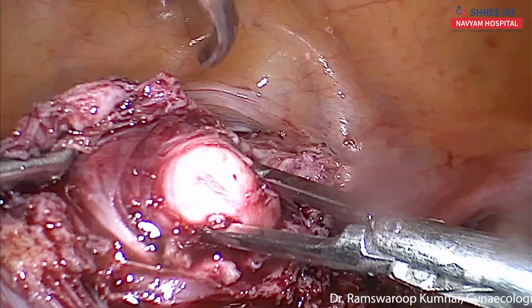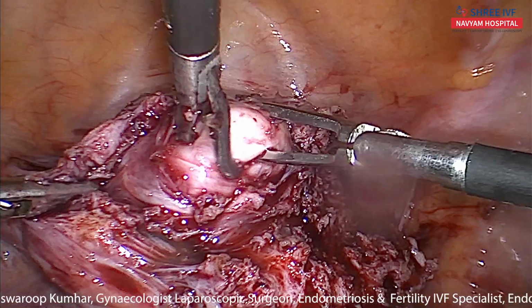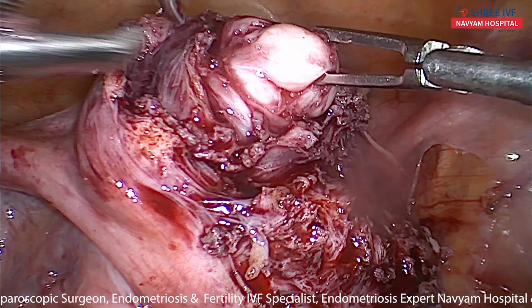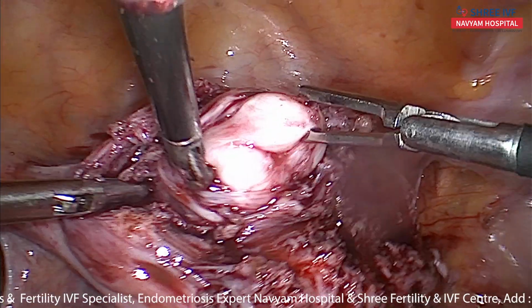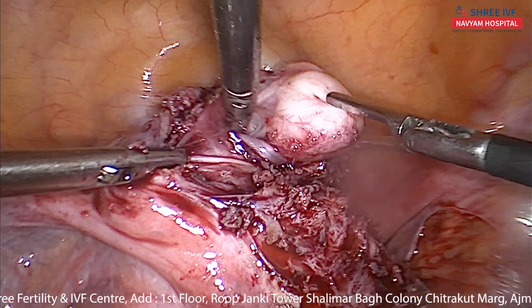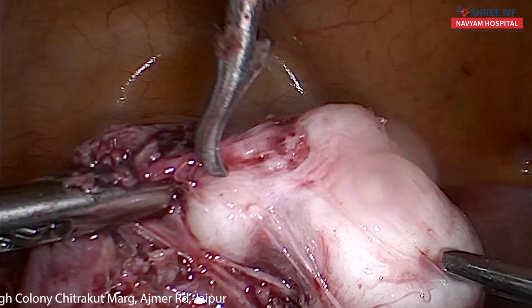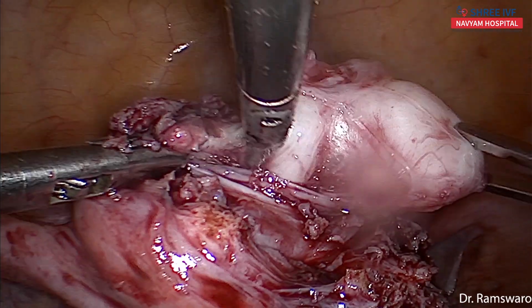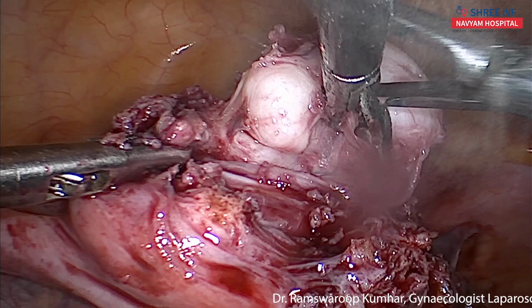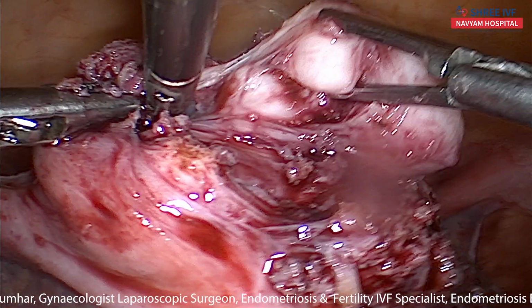Hold with the tenaculum and give traction. Give traction. Enucleate in the proper plane, and this multilobulated small myoma is out. It is multilobulated.